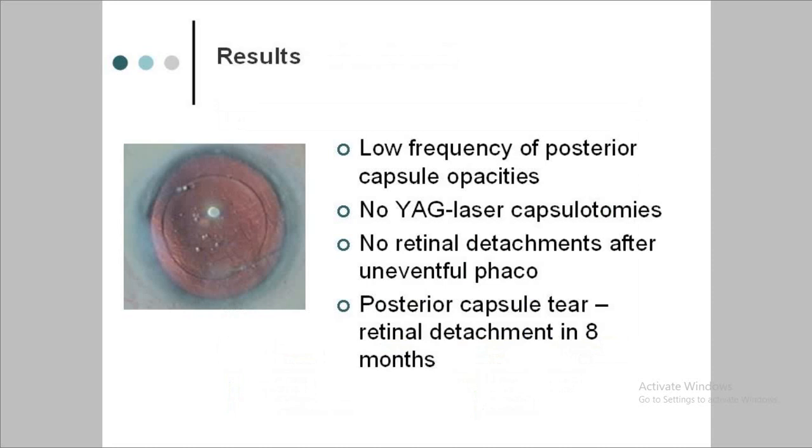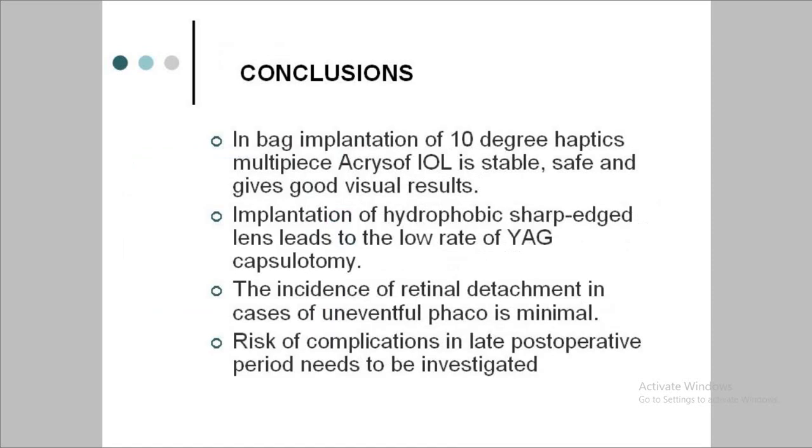We observed low frequency of posterior capsular opacities. No YAG laser capsulotomies were needed during the follow-up period. The IOL position was stable. No folds of posterior capsule were observed. There were no retinal detachments after uneventful phacoemulsification, but unfortunately the case of posterior capsule tear led to retinal detachment in 8 months period, and vitreoretinal surgery was performed.